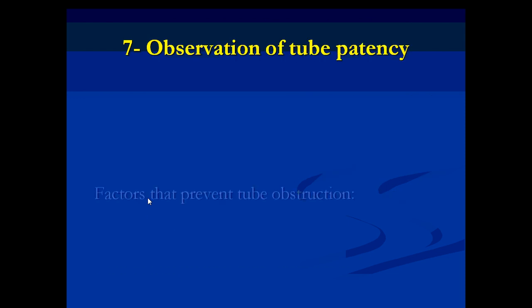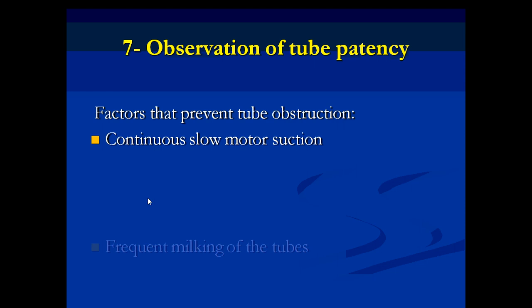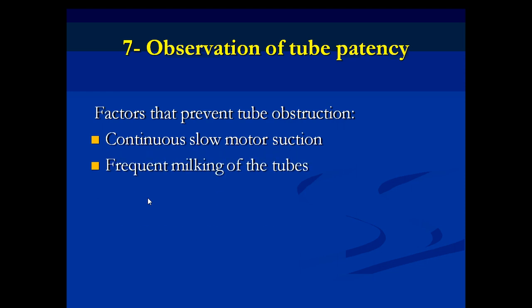Observation of the tube patency should be done every day. How can we prevent tube obstruction? By continuous slow motor suction just after surgery, keeping it continuous, and frequent milking of the tube, so we don't allow any clots to obstruct the chest tube.